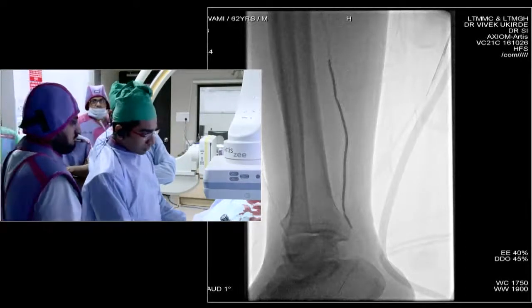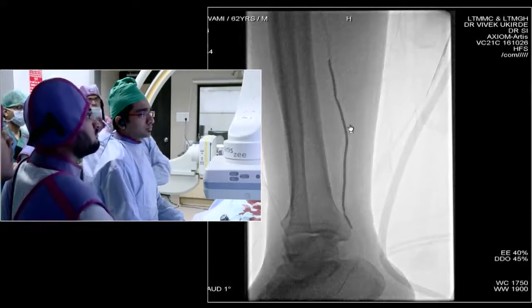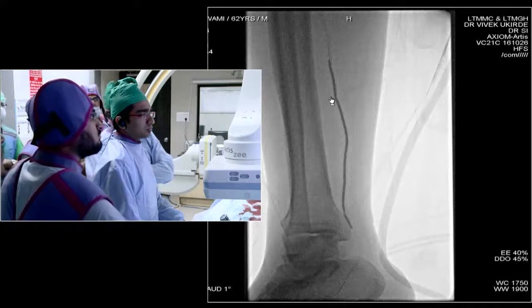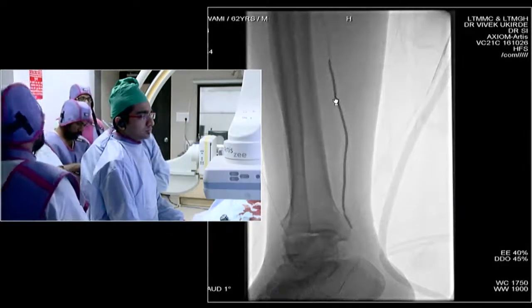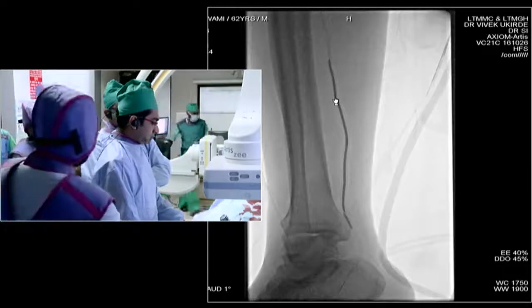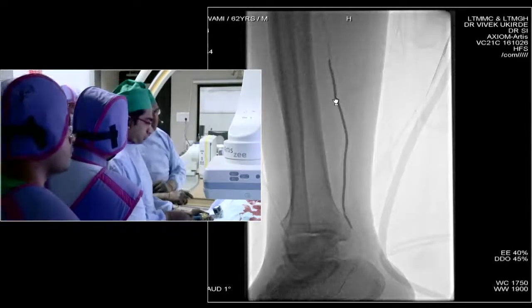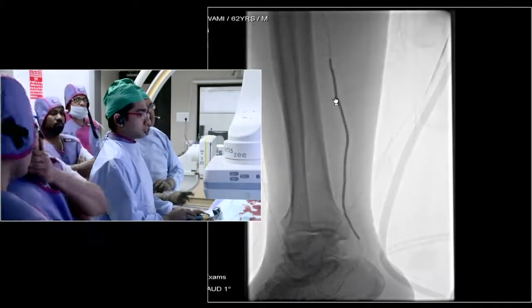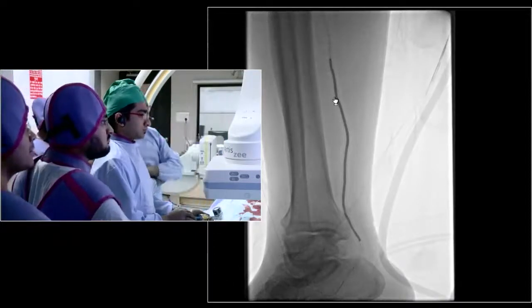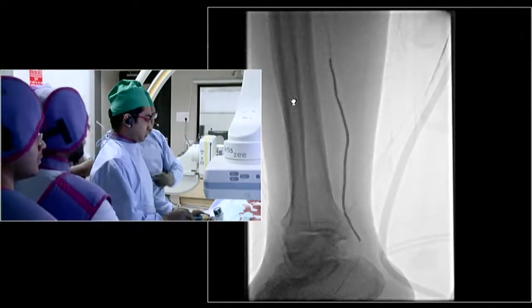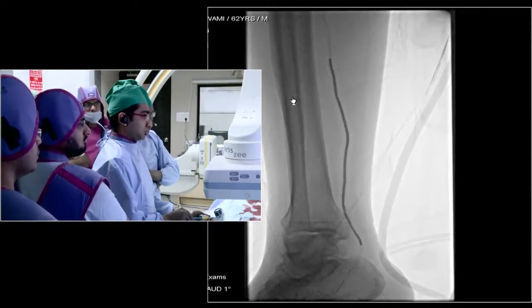We have already put a marker on the screen so we know exactly where to put the scaffold. There is still a waist on the balloon at two levels. I wouldn't mind inflating a little higher and holding the balloon for a little longer — maybe three minutes dilatation at higher pressure, up to 14, 16, even 18 or 20 atmospheres. The waist is now gone; we are at 10 atmospheres.